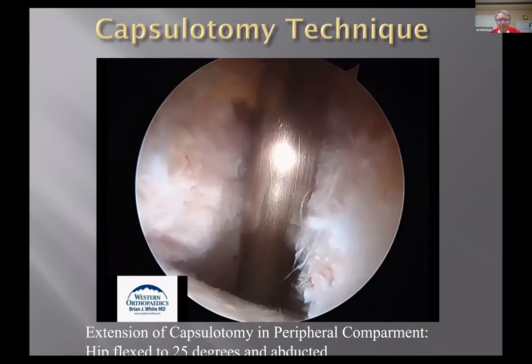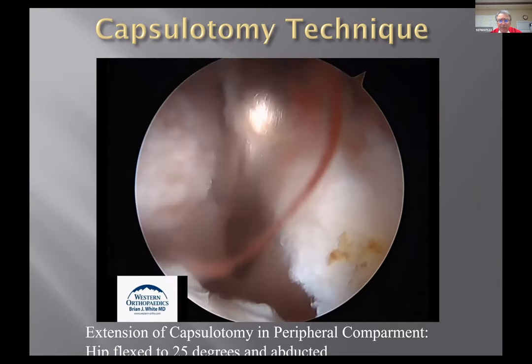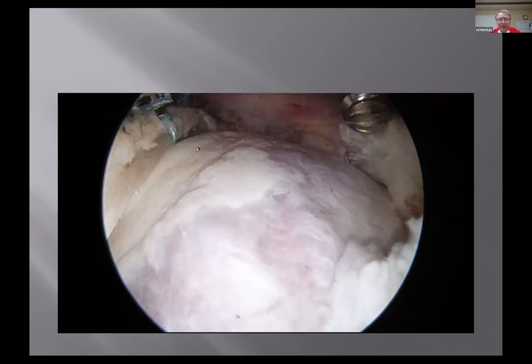Yep. But here again, you can see he can get all the way medial, and you know that gives us exposure. It gets you room to get in the hip periphery. And again, you're not in the central compartment. You see traction's off on the x-ray. And now you're looking at a labrum that's already been fixed, but you got this big cam lesion. So how do we address the cam lesion?